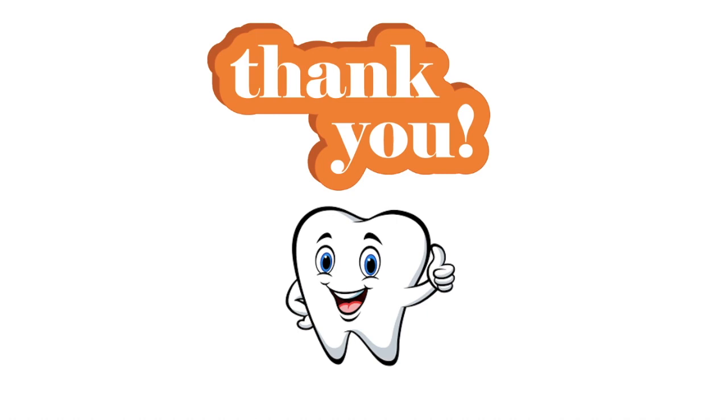Now you look in your instrument kit and let me know if there is any doubt regarding this.